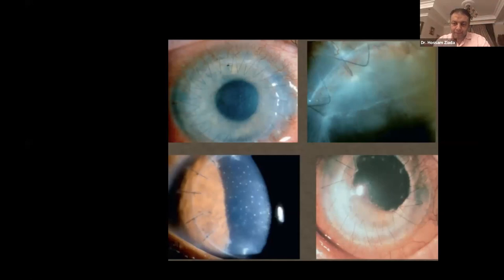Yes, it is. I think it is the tight sutures and it's inflamed from the nasal side. The stitch is inflamed and swollen. The cornea is also swollen and inflamed. Okay. You may think that removal of these stitches will stop the progression of the neovascularization. As Dr. Gustavo said, it will be removed to stop progression of the neovascularization?